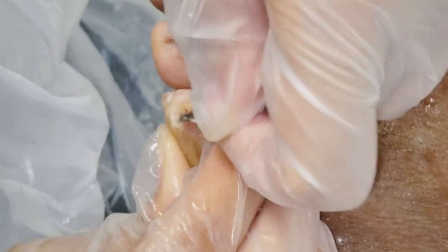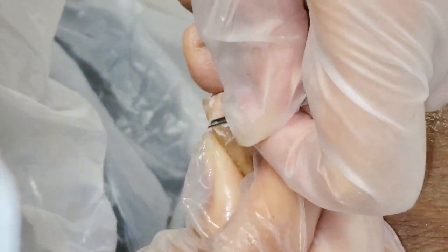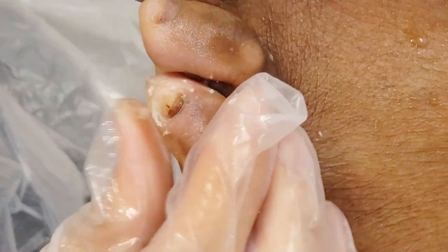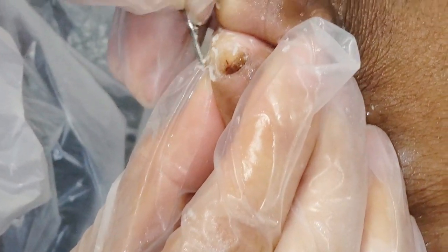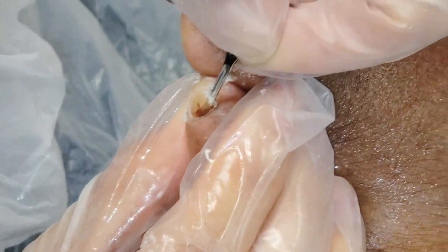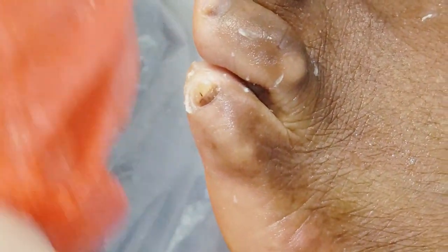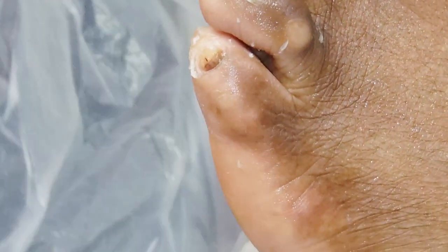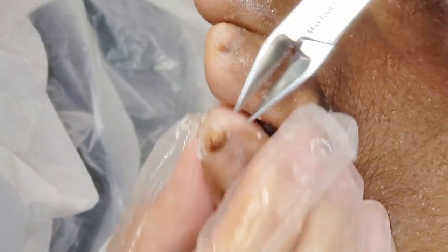We've got our classic screw blade that does everything from cutting nails to taking out corns — we love it. Have you seen this blade? Did you just watch the nail videos? So those are your favourites? There's some corns and calluses. Everybody asks what is this blade, and that's the blade.